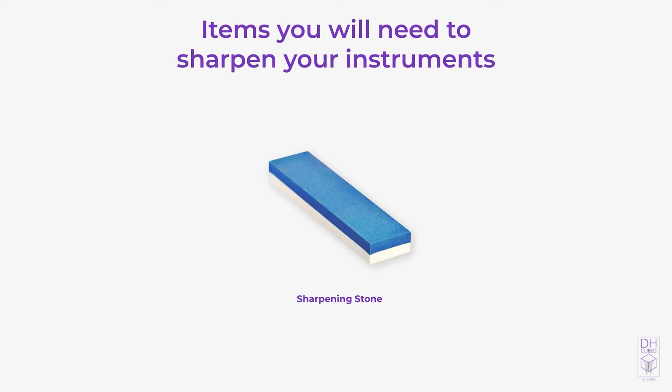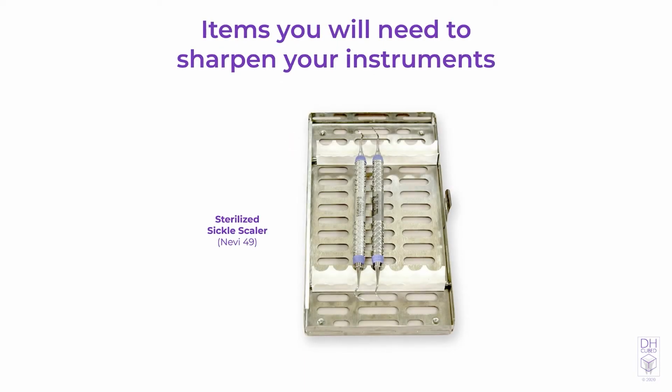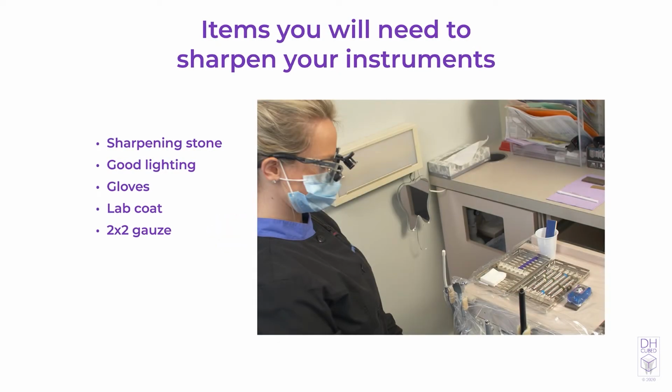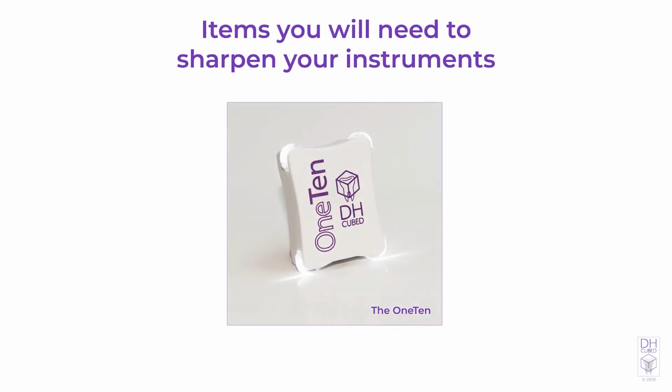You can spray a little water on the white side of the stone prior to use, or you can use the rubber band system to secure the 110 to the stone if your particular stone requires oil or water submersion to lubricate it. A test stick. You can use the test stick you can purchase or use the disposable hard plastic air-water syringe tips. A sterilized sickle scaler. We will be using the Nevi 49 from Hu-Friedy for our demonstration. The technique we are teaching can be used for all sickle scalers. In order to sharpen well and correctly, you will need good lighting, either the LED light on your loupes or the operatory light. And finally, the DH Cubed 110 sharpening device.